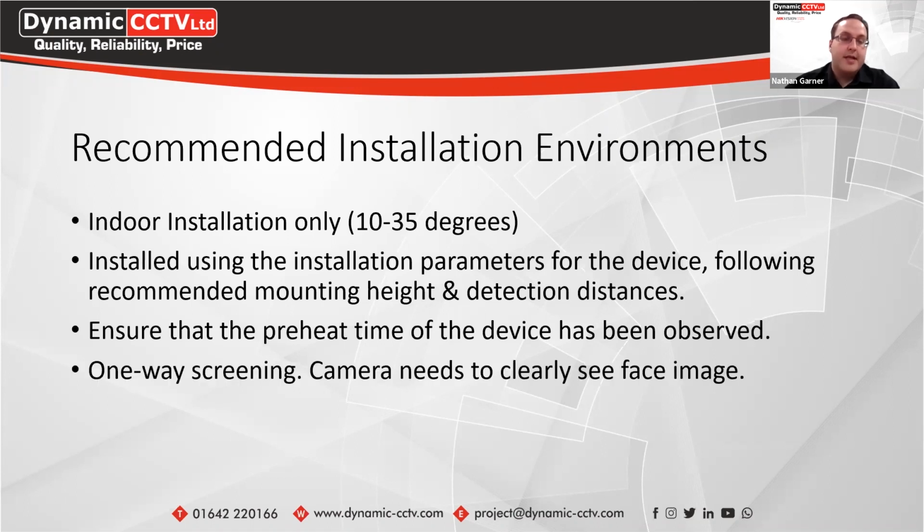It's also best to set up a one-way screening channel, so the person is walking towards the camera, and the camera also needs to clearly see the person's face. So if they're looking down or anything like that, that can affect it. Masks are fine because it can then read the eyes and everything as well. It's just if the forehead is covered by the person.